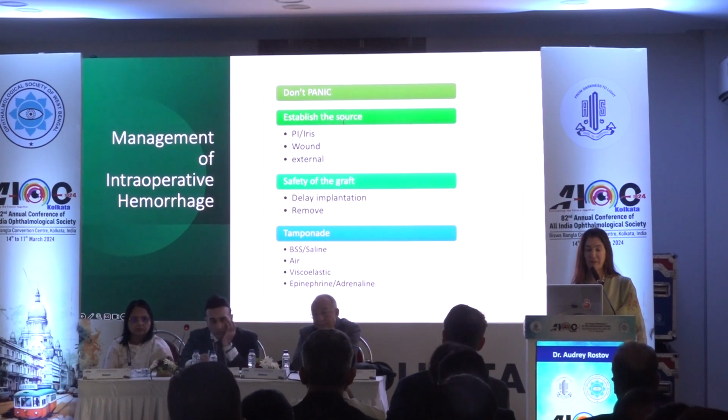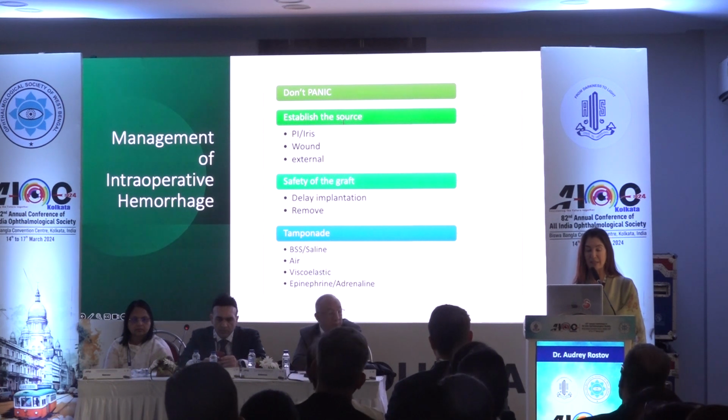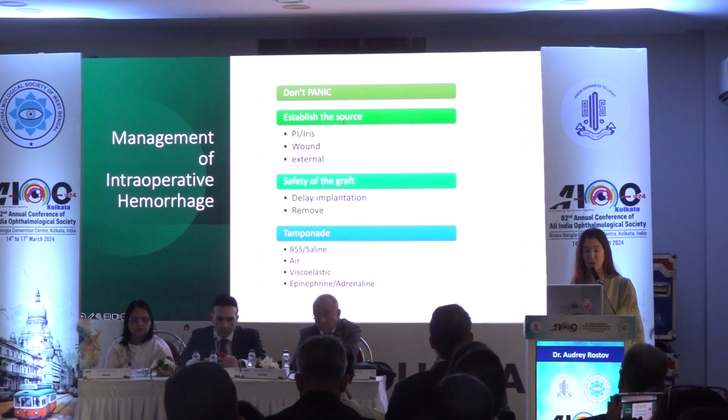Management of intraoperative hemorrhage. Number one, do not panic, take your own pulse, establish the source, maintain the safety of the graft, and then tamponade with whatever you have: air, viscoelastic, epinephrine, adrenaline, BSS, whatever you think will work at the time.